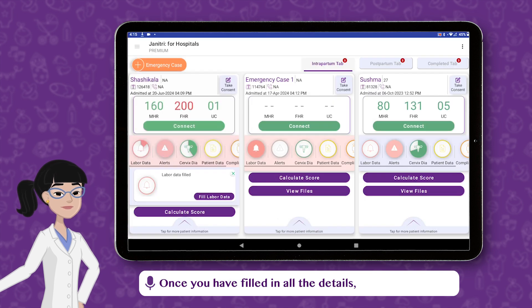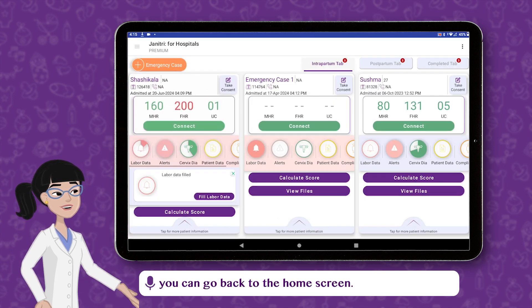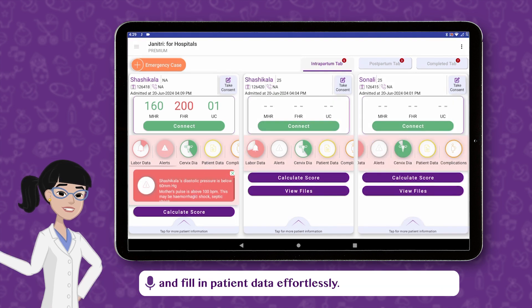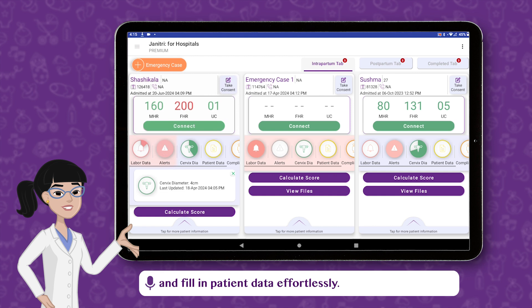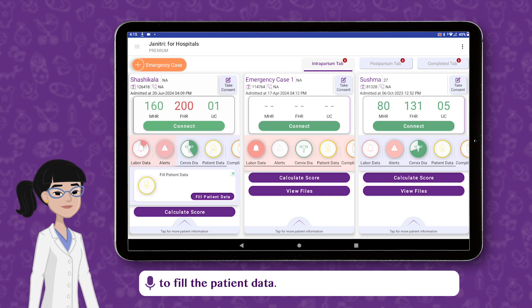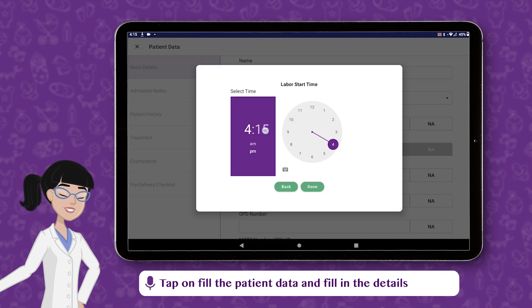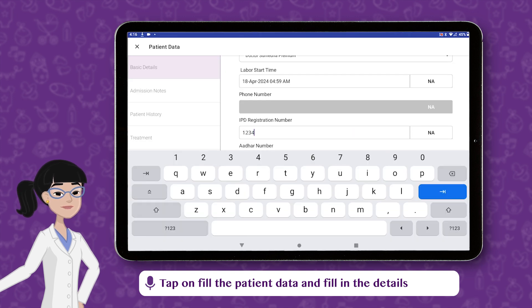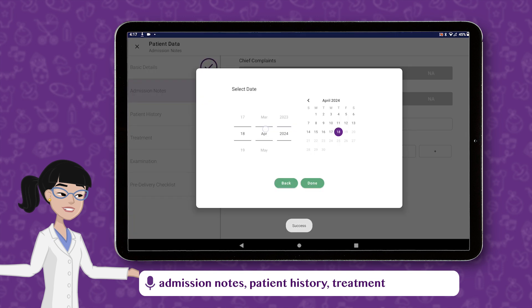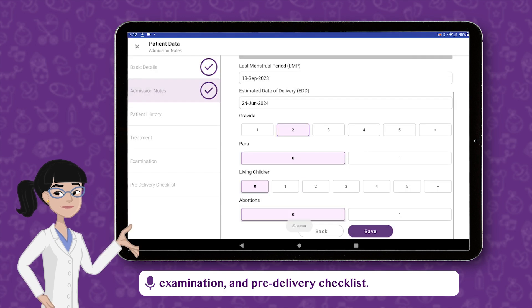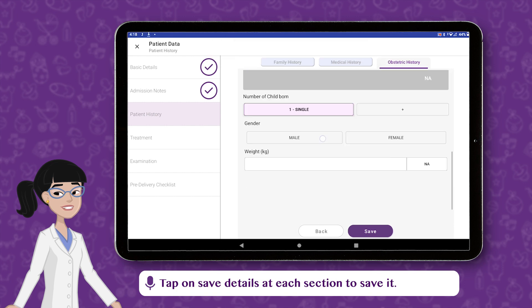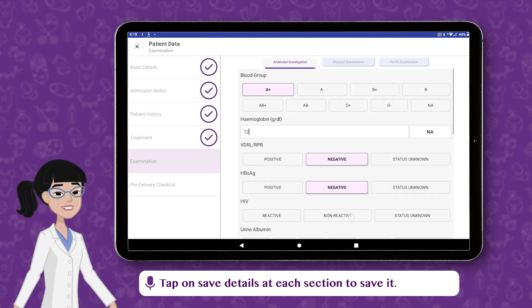Once you have filled in all the details, you can go back to the home screen. You can see and manage alerts, do cervix assessment, handle complications, and fill in patient data effortlessly. To fill the patient data, tap on Fill the Patient Data and fill in the details such as basic details, admission notes, patient history, treatment, examination, and pre-delivery checklist. Tap on Save Details at each section to save it.